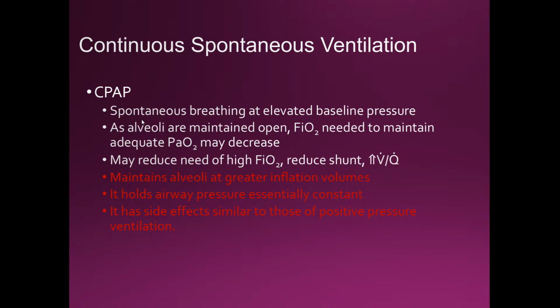I will slap them on BiPAP. Why? Because I have a backup respiratory rate. So if they fail to breathe or they're breathing slower, guess what? My backup rate will get them to breathe at whatever I set it to. So if they're breathing down at 6 breaths per minute, I'm going to switch that out. I'm going to give them 12 breaths per minute, 15 breaths per minute, right? So that I can increase that minute ventilation for them so that they can breathe better.